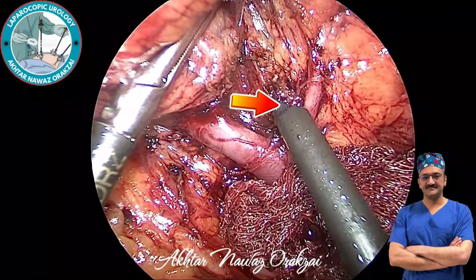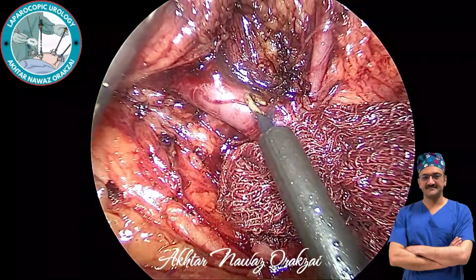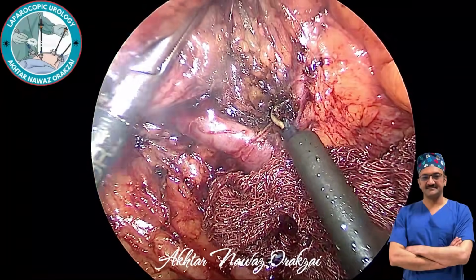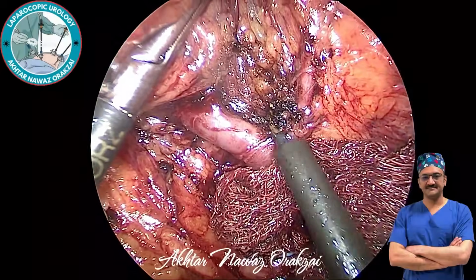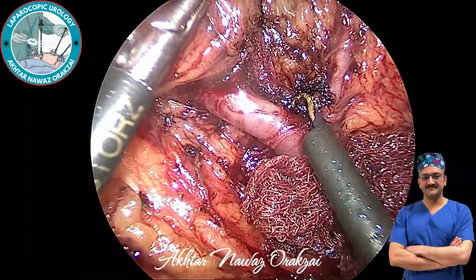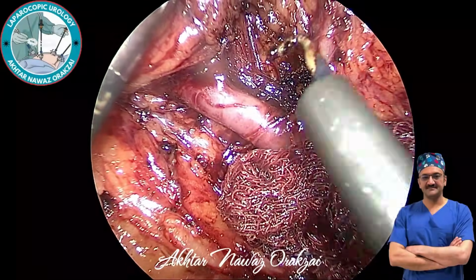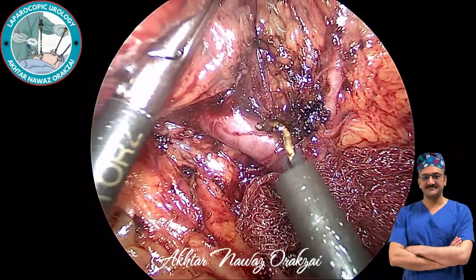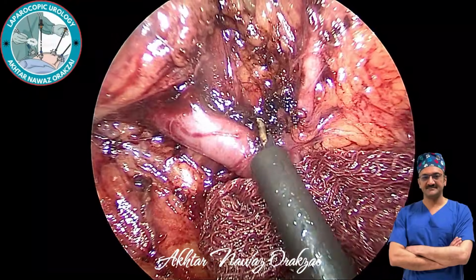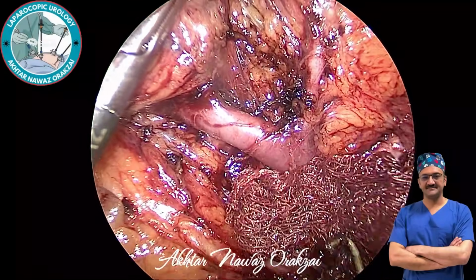Here you can see the pulsations of that artery, because it is very near here and is dividing into further branches, and it is also giving one branch to the adrenal gland. So we need to dissect everything away from that artery in order to avoid any injury, and thus the ischemia to the upper pole of the kidney.